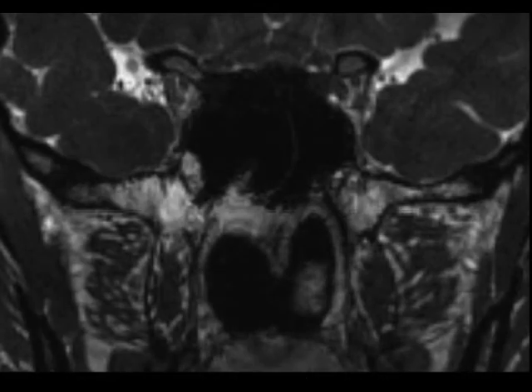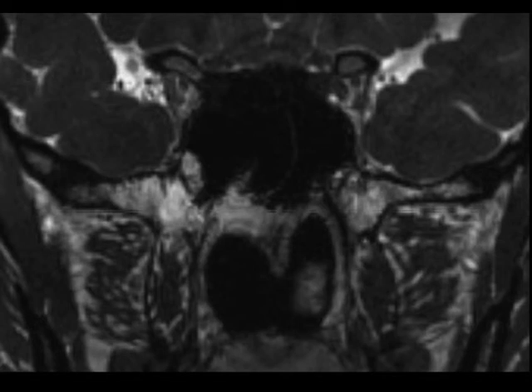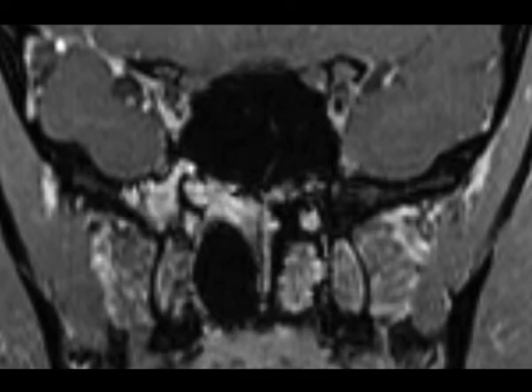Although this case is not an example of a florid primary presentation, we see a good example of recurrent or residual disease in the sphenopalatine foramen, which is where these lesions classically arise. These are benign lesions histopathologically, but appear infiltrative and aggressive in their typical pattern of growth. They frequently involve the pterygopalatine fossa and may extend into the nasopharynx and nasal cavity, as was evident in this case.